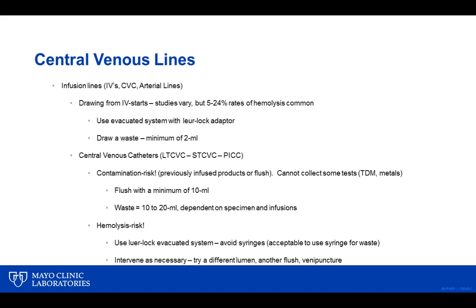Certain infusions, particularly things like dextrose, TPN, or anything that would affect antibiotic assays, have a real tendency to dwell in the lines.